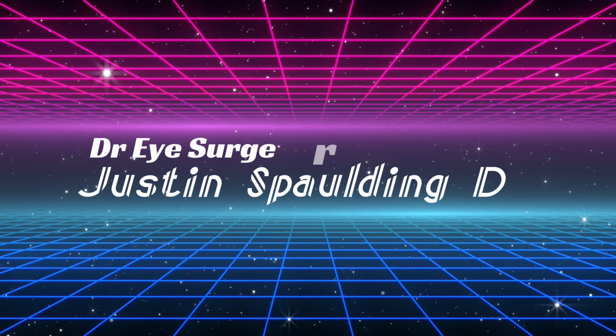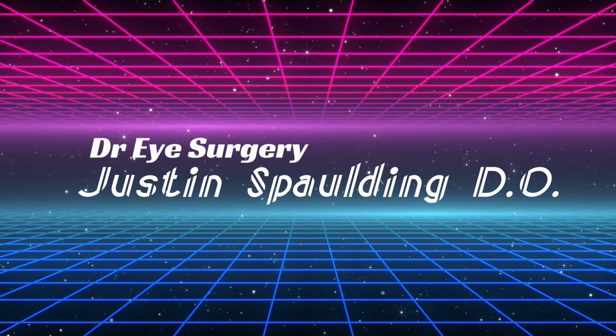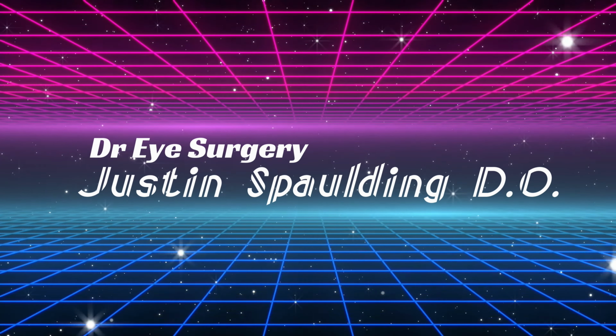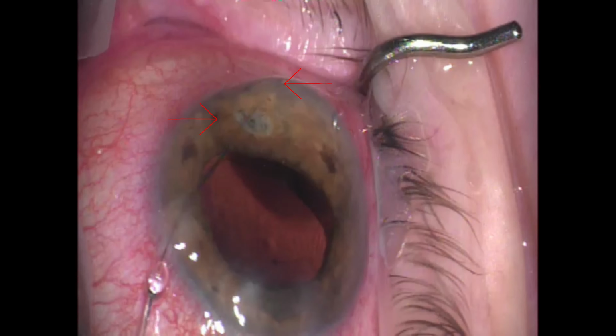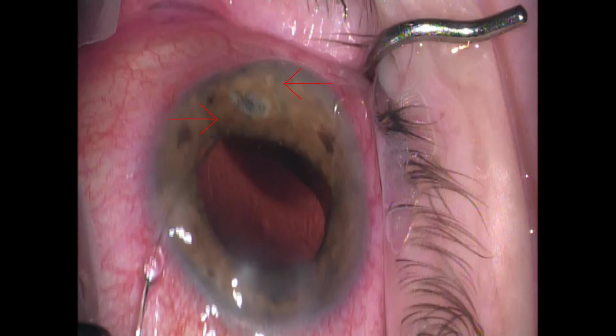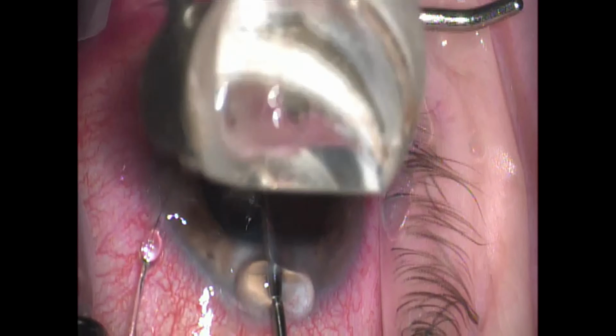This is an acute angle closure patient that I've recently seen. They came to me from another physician with two PIs already in place. What I'm showing you right here are the two PIs. I've already taken out the cataract. I'm just putting you into my gonio view right now. I've already tilted the head and the eye approximately 30 degrees.